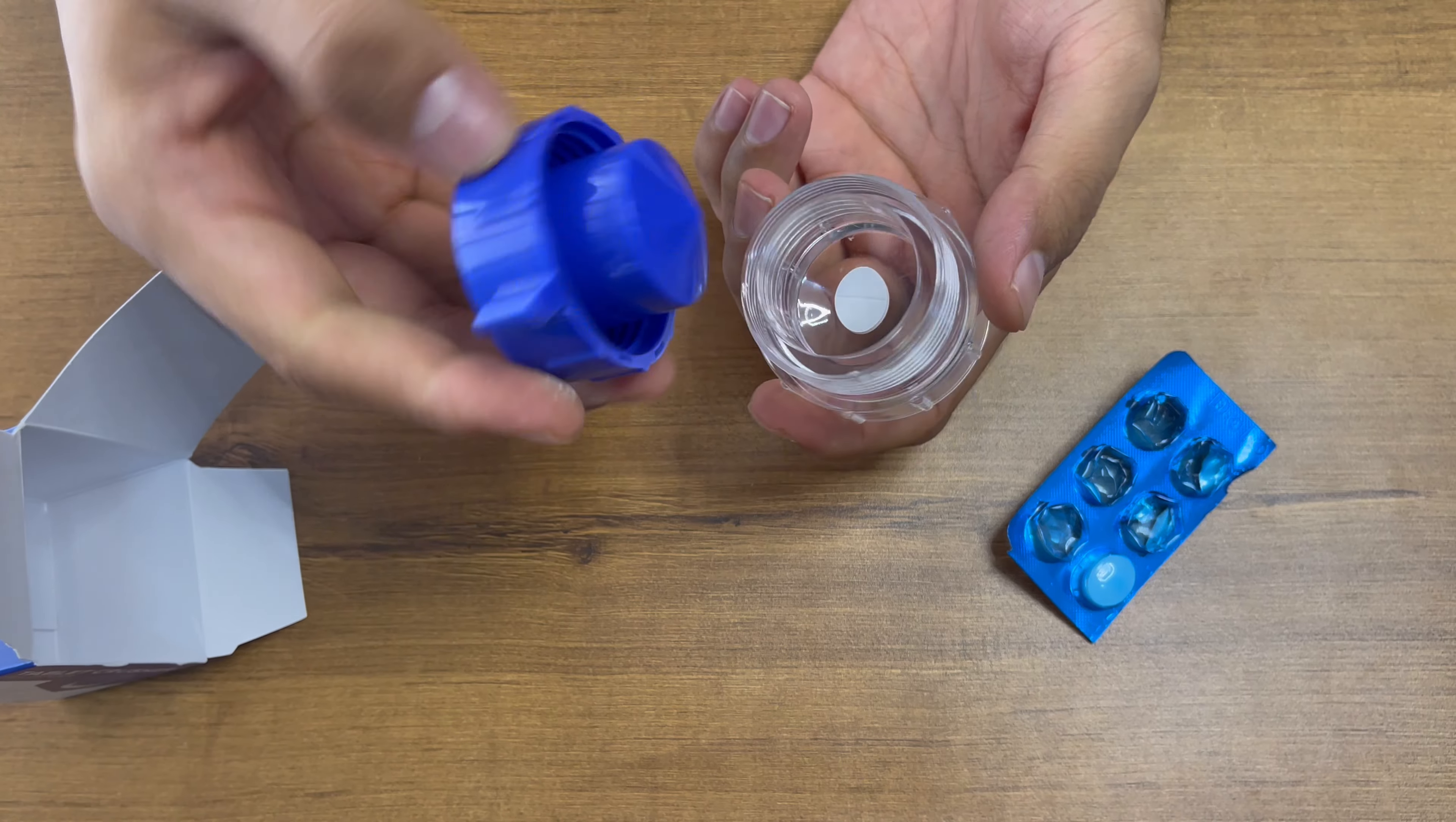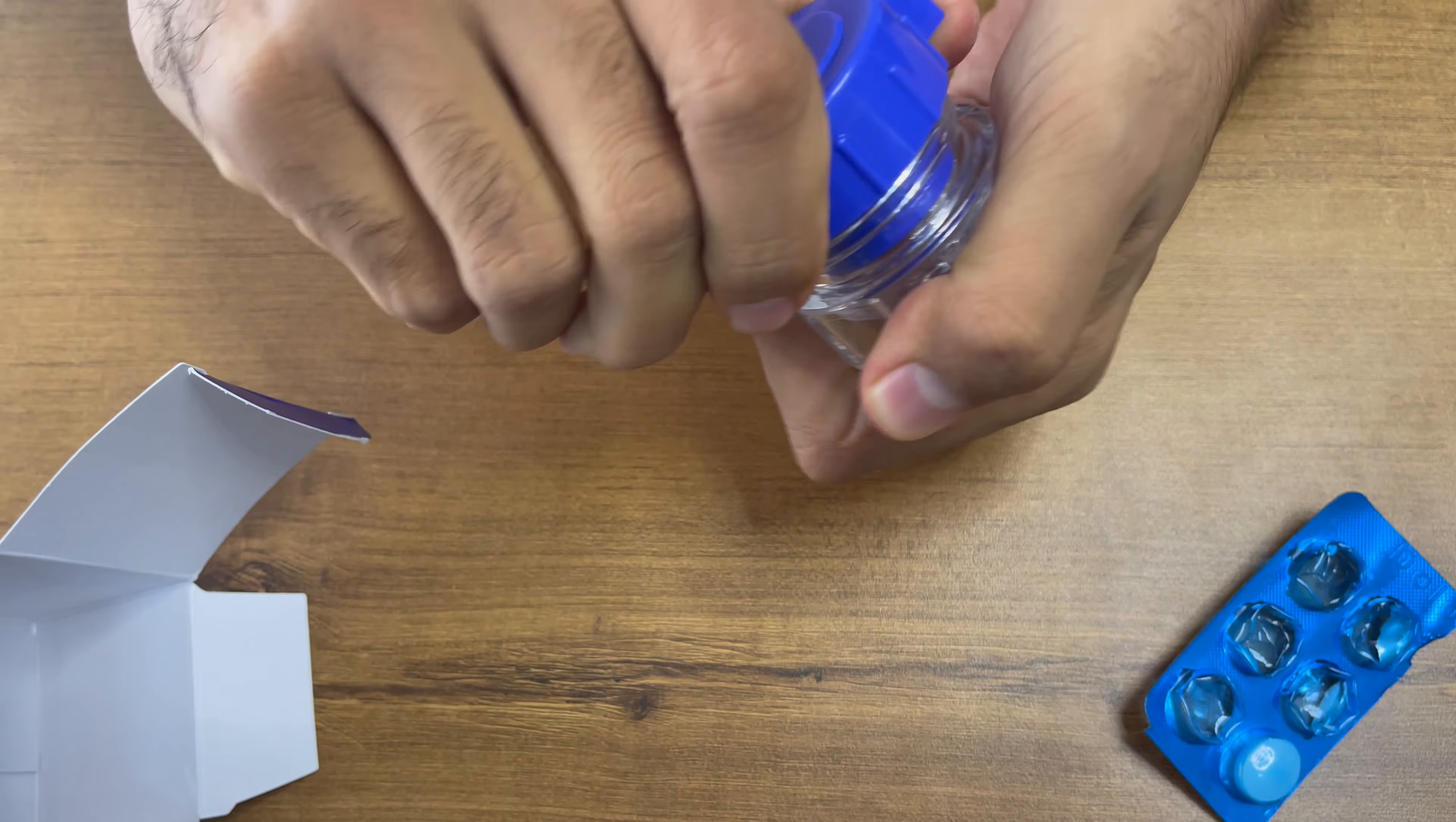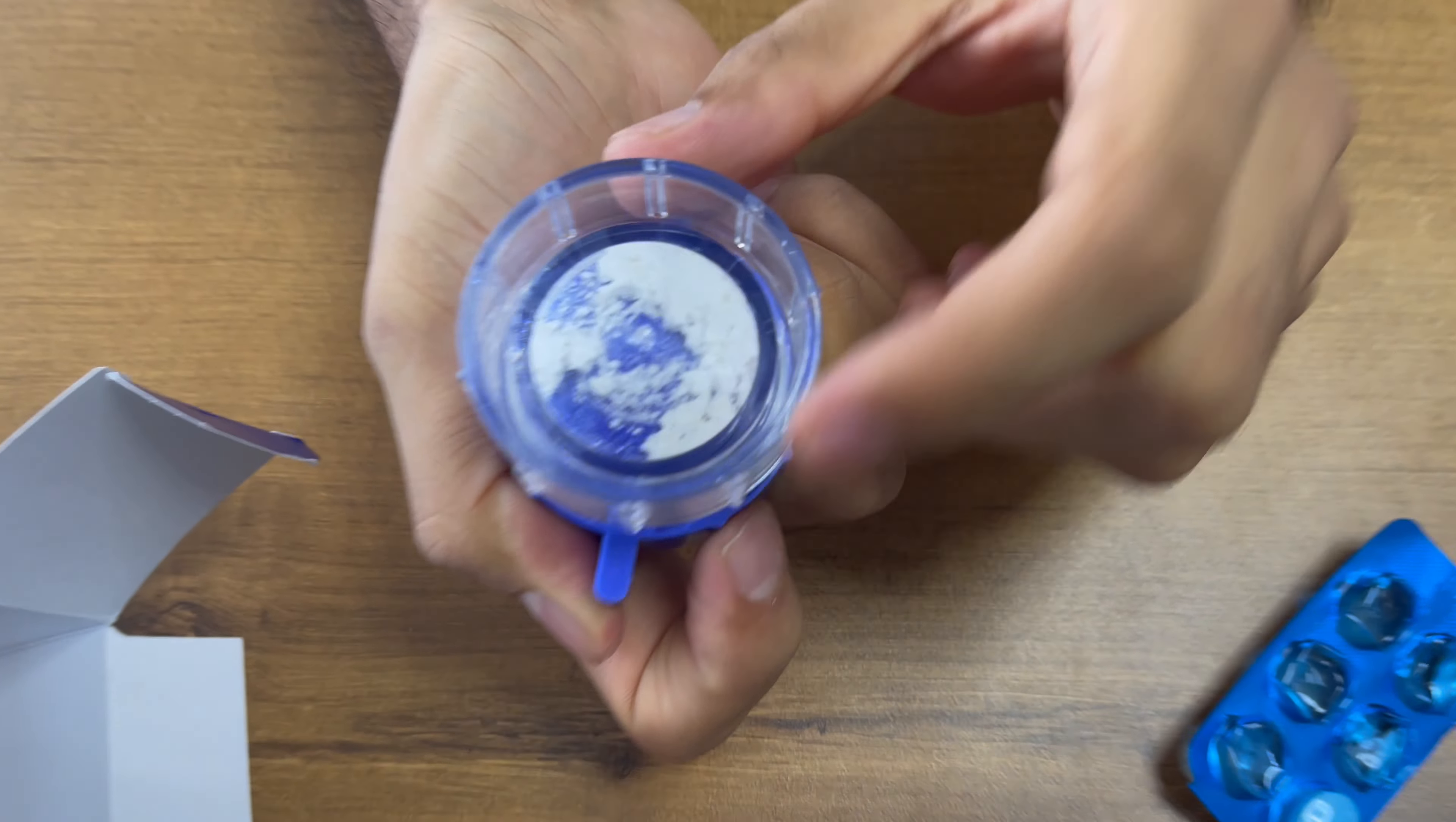We are just having a try of it. You just need to turn it like this, and then again unscrew and screw. You just need to apply some force. You can see the tablet has become powder.